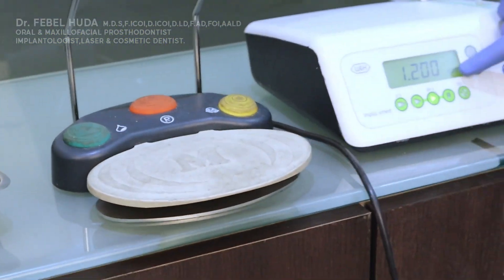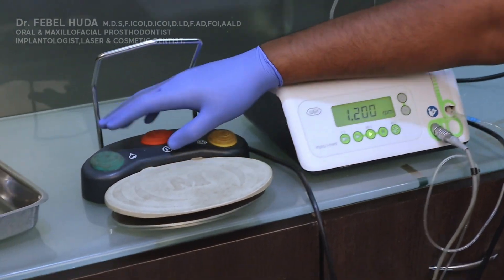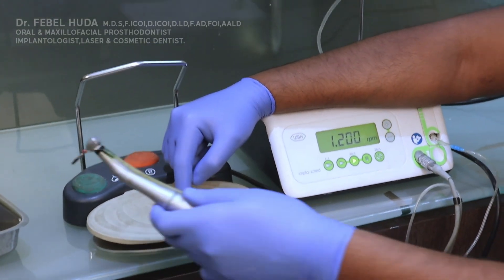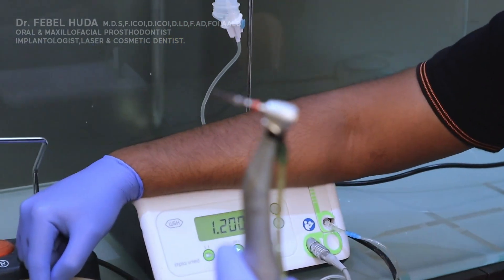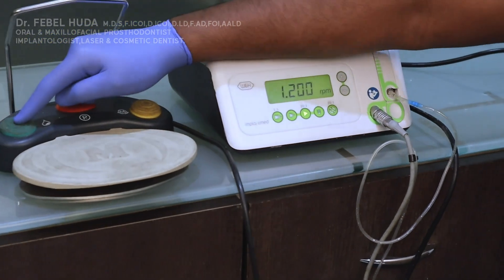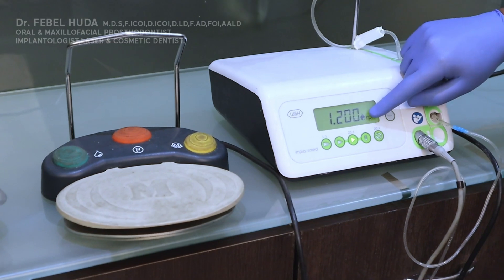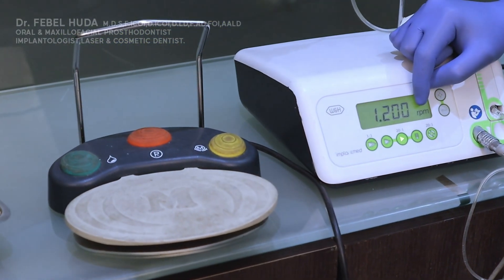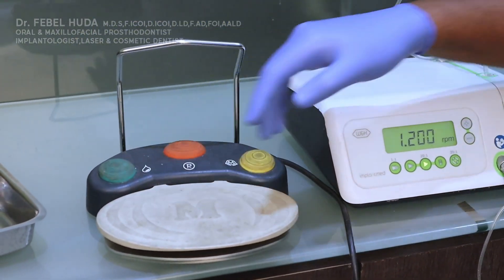Before explaining further, I'll show how the foot pad works. One pedal is pressed to run the drill — you can see the drill is working. The other switch controls saline: press it and the saline is active; press it back down and the saline is off. You can see the droplet icon disappearing — you use your foot to control saline as well.